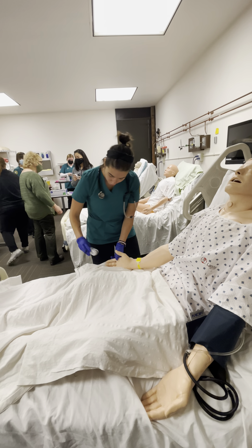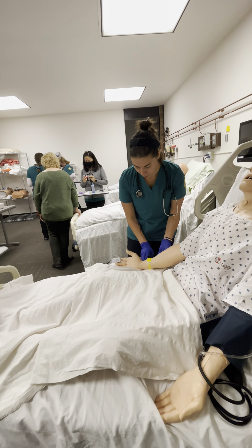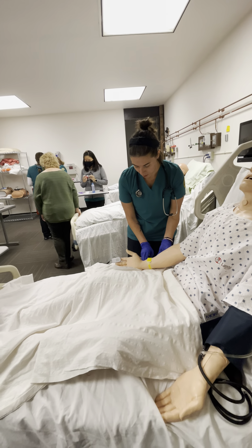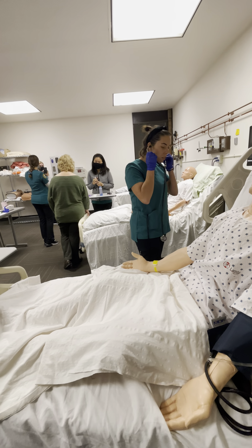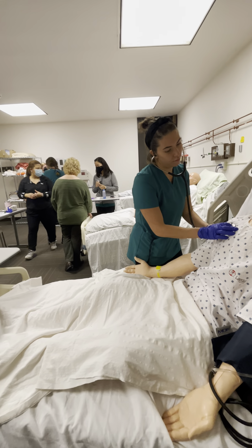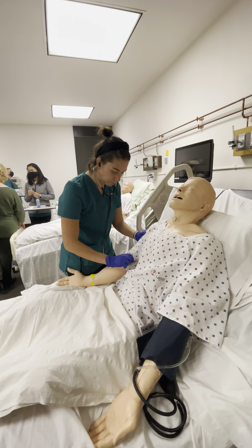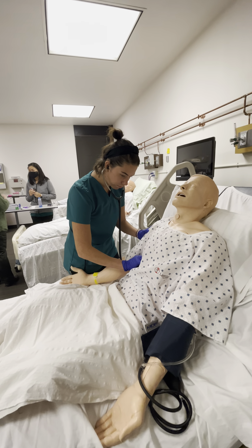Okay, I'm going to check your vitals again — check your pulse. Okay, that all looks well. Go ahead and listen to your breath sounds again. Nice deep breath in and out.